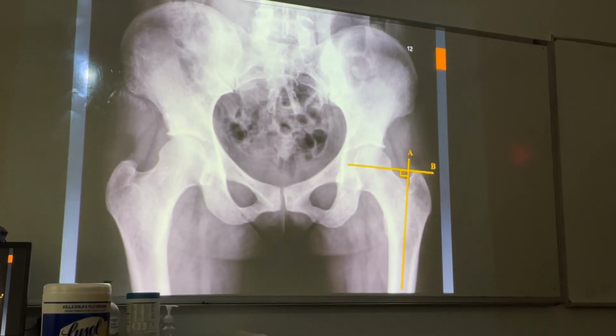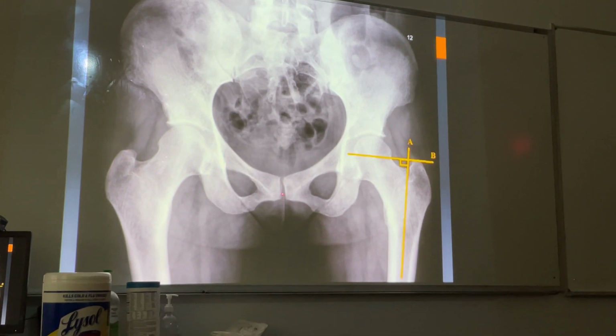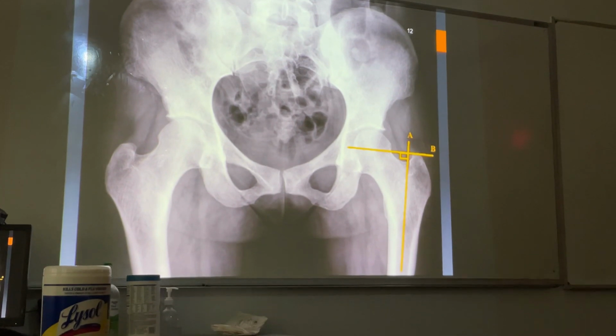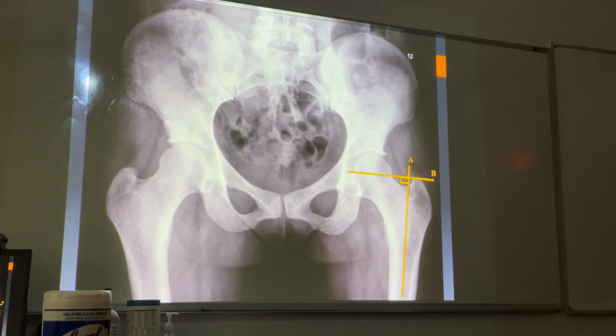and that's called the four corners principle, meaning if there was a big lesion sitting right here, we would probably all see it because it's midline, but disease processes don't understand that. They like to hide in the corners of the film, either proximally or distally, so I'm just explaining it in a different way, okay? And you'll see enough examples of what I mean so that you get the point.